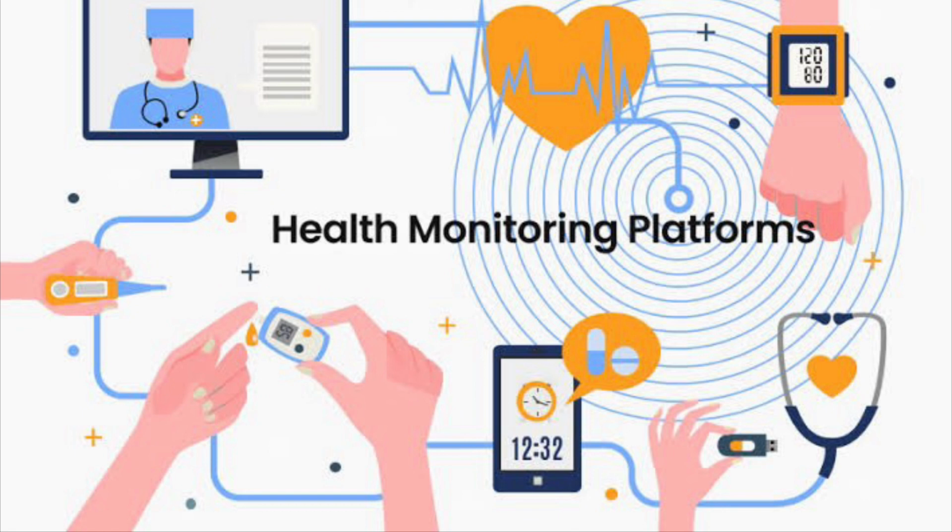And second, the next step is the care coordination software to help you manage the continuous vital signs monitoring. Technology wise, it might be easy to generate continuous data. But the problem is what we do with the data. How are we going to monitor the data? Is the data going to be remotely monitored by some other office? What is the security of this data? Is it going to be a domain which is not secure, because it's healthcare data? And what is the professionalism of the people who are looking into this data?